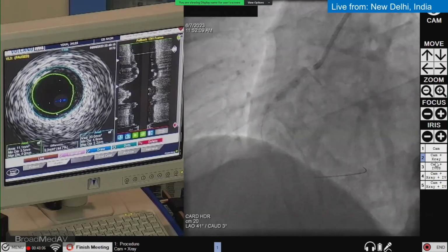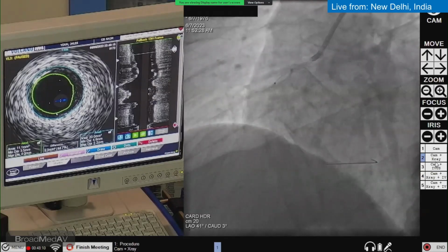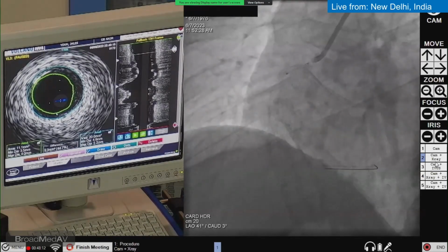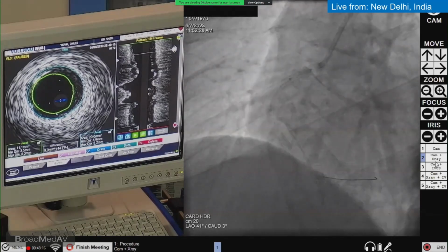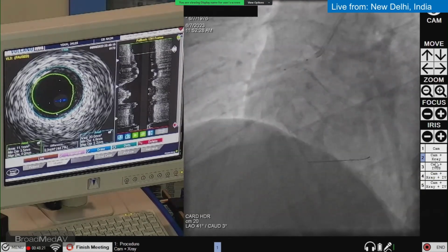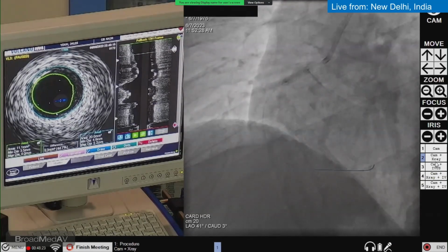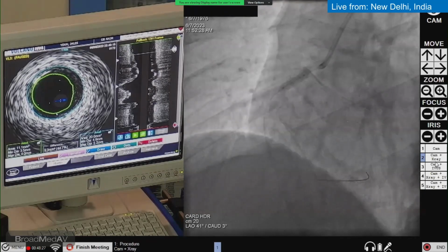Okay, deflate. Go up 2, 4, 6, 8, 10, 12, 14, 16. Deflate.